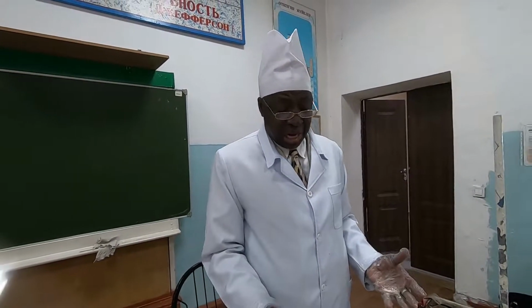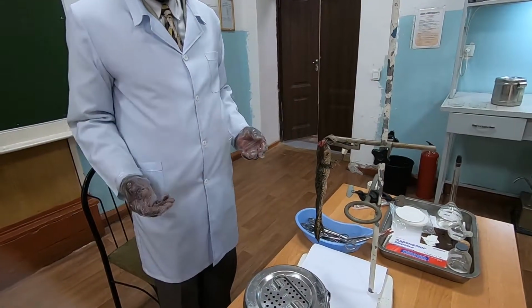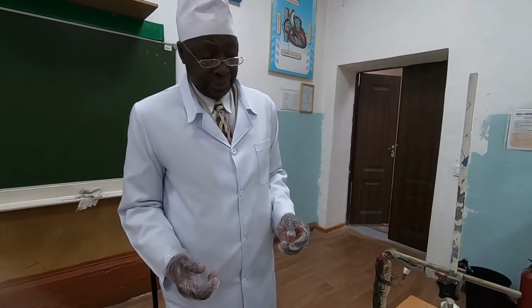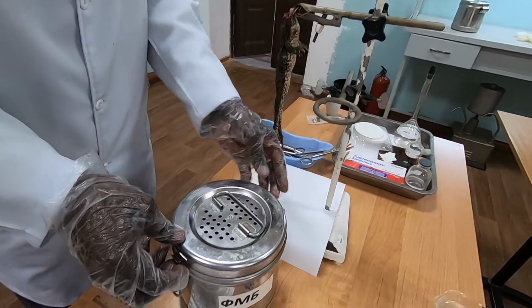So this is what is happening now with our object, that's the frog. After some time, you will see its reaction. So we leave it here while hanging, and then we go to our eye.